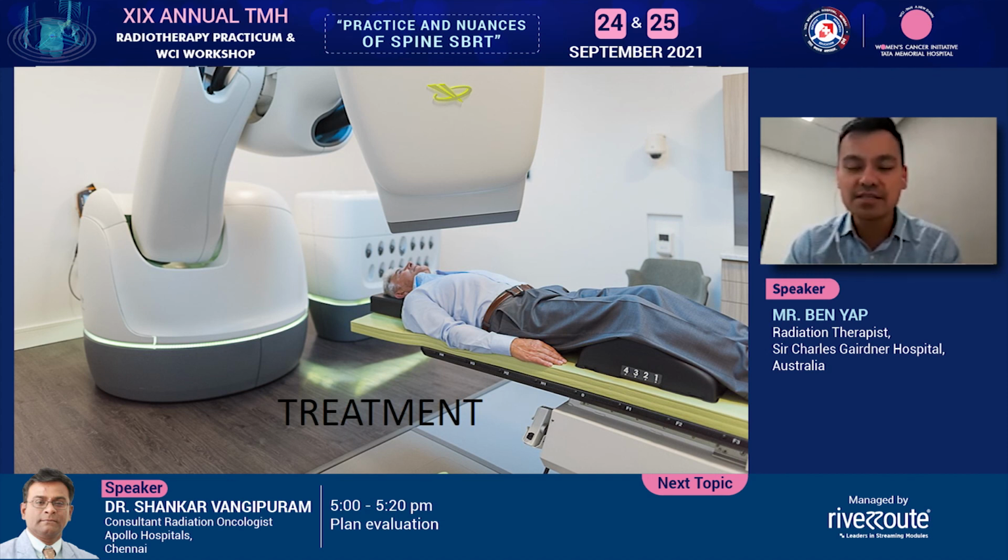If you have a high uncertainty, I would definitely recommend that you play with your imaging technique. It's perfectly okay to increase or decrease your mesh, the blue grid. In some cases, you may have to increase your mesh at the cost of uncertainty to have a more consistent offset and tracking for numbers. Again, to be at the discretion of the user, of course, and use clinical judgment at all times.